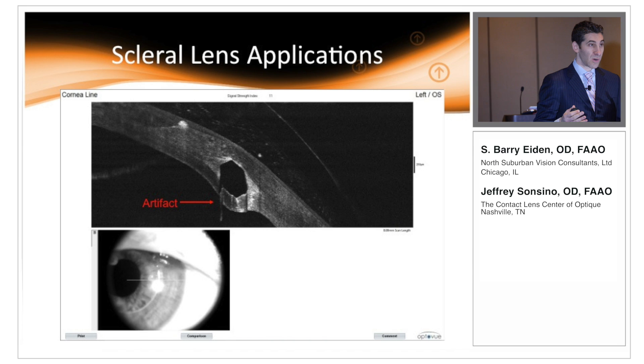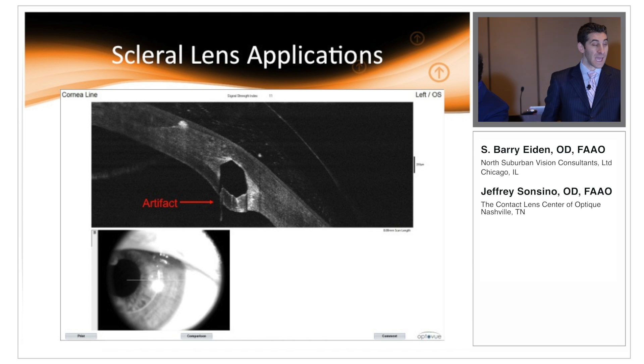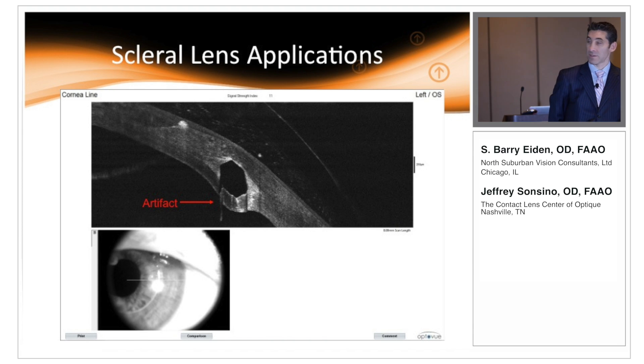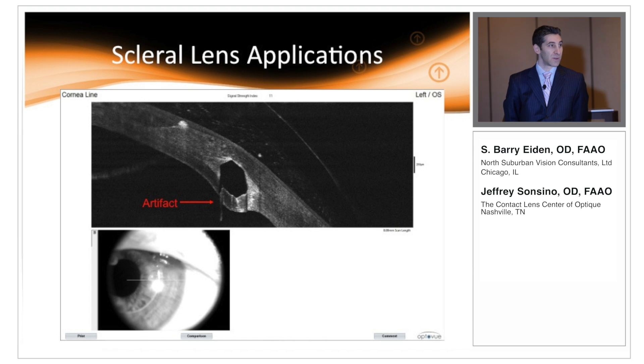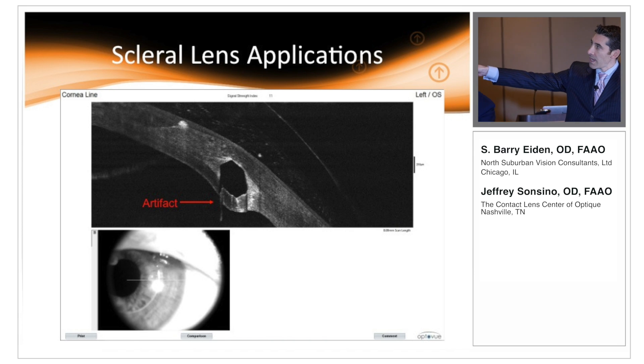I got a phone call in the middle of the day from an extremely prominent scleral lens fitter. He said, 'Oh my god, I've got this patient with intacts and he's got a posterior epithelial detachment.' So I looked back at about 15 of my post-intact scleral lens evaluations and every single one of them had this finding. We're actually publishing a case series of this exact phenomenon. But I can assure you this is not a posterior epithelial detachment — this is just an artifact related to index of refraction issues.